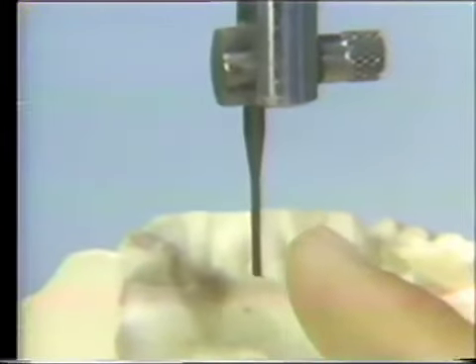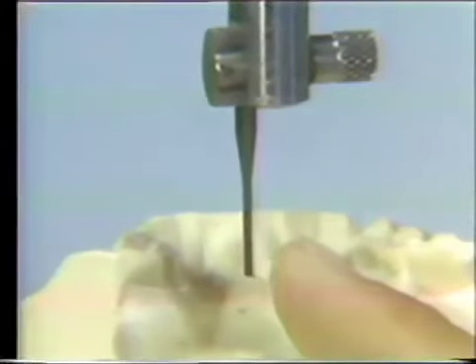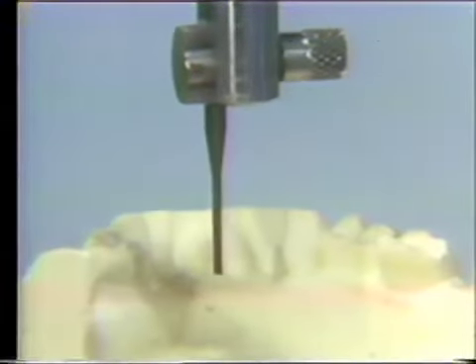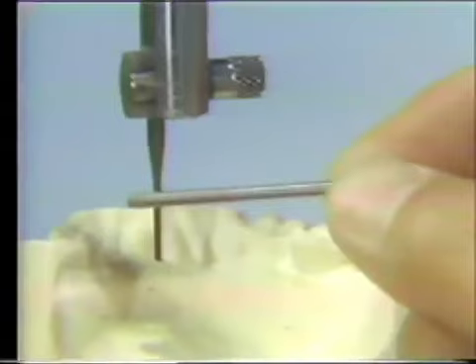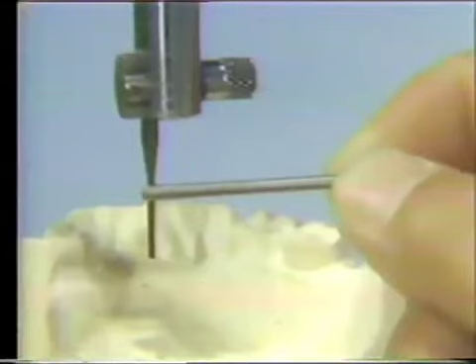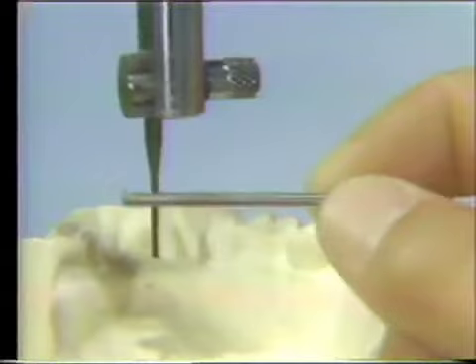It should be perpendicular, and it should be checked by rolling it on the desktop or by using some other gauge such as a right angle to check it against. Another thing that can be used in place of the analyzing rod is a shank of a straight handpiece burr. This will work as well for an analyzing rod.